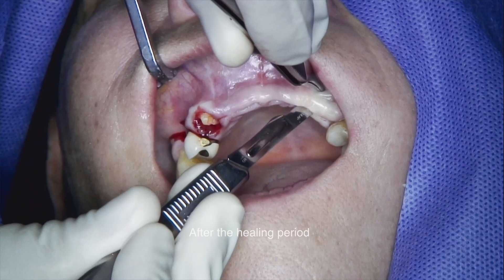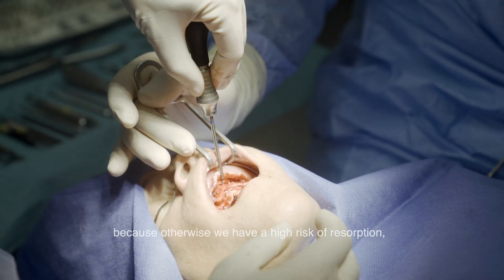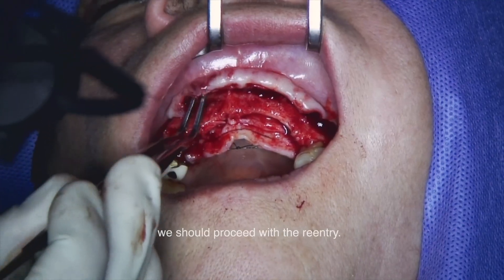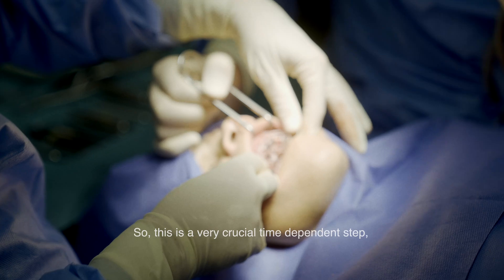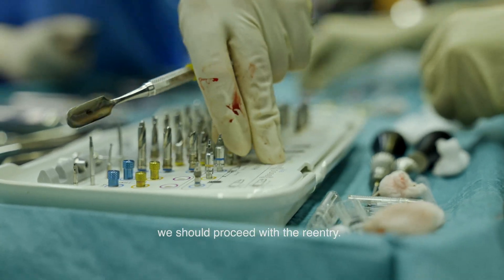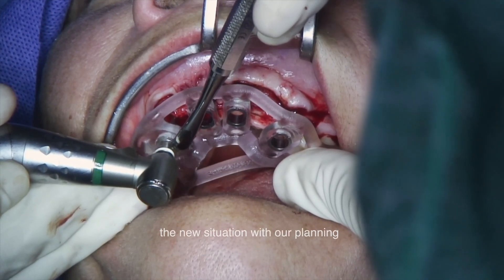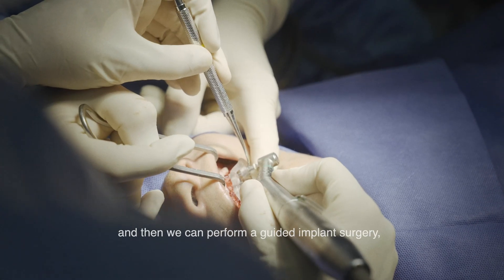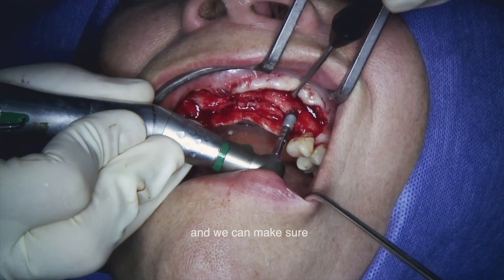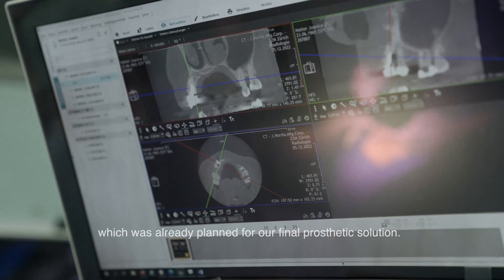After the healing period, which should not exceed five to six months — as a longer period increases the resorption risk — we perform the re-entry. This time-dependent step is crucial. At re-entry, we match with our prior planning and proceed with guided implant surgery to place the implants in the prosthetically planned position.